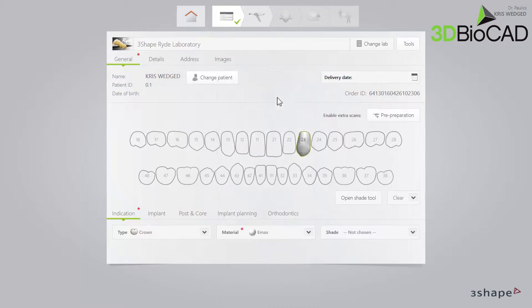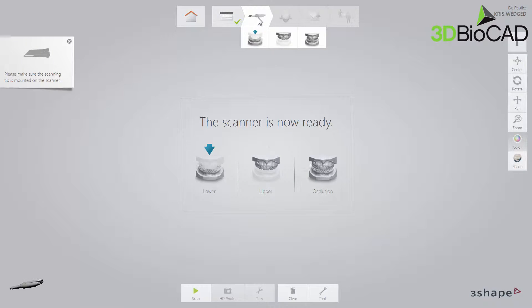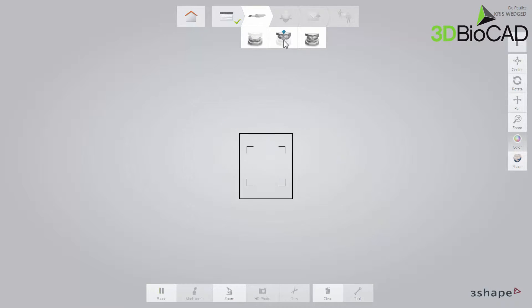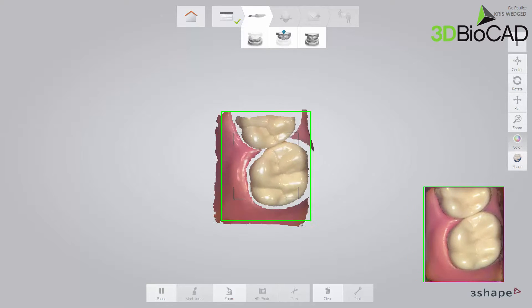When your order is ready, proceed to the scan page and make scans using the recommended scan strategy. For the purpose of this video, only the upper scan will be made, where the restoration is. In order to do that, select the upper arch in the workflow bar and start scanning.